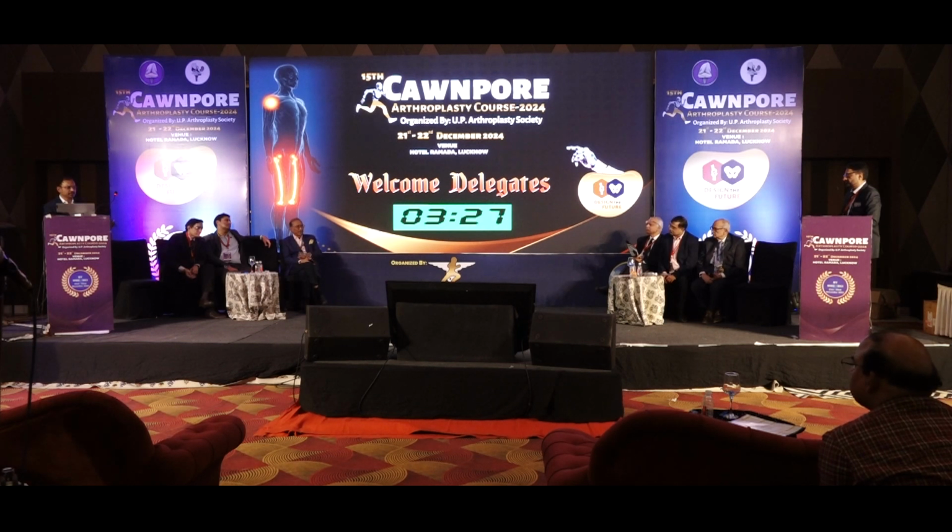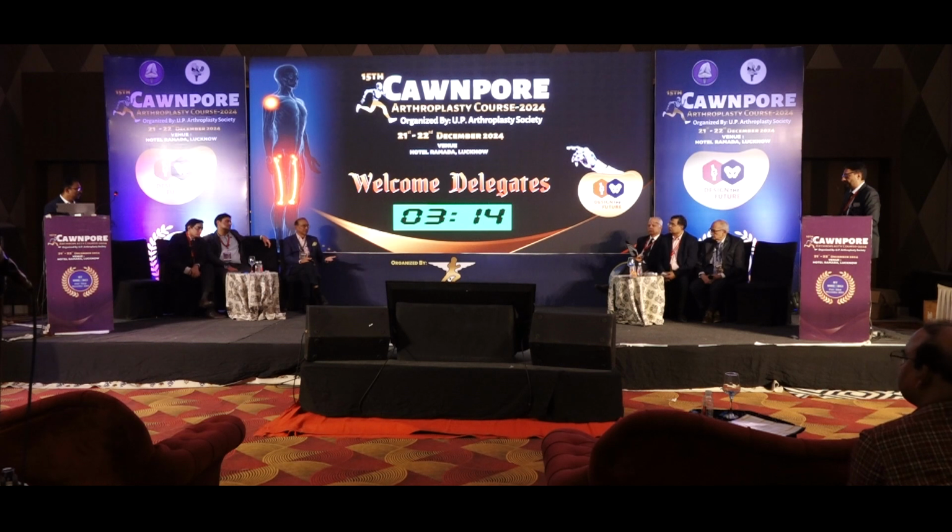And the first time I did a PS knee, it made my life very easy. And the result was definitely, the early recovery was no less than a PS knee. So those 3 years gave me thinking, and the time was around 15 minutes less in a PS knee. The first time I was scared, and still I get scared with the notch.